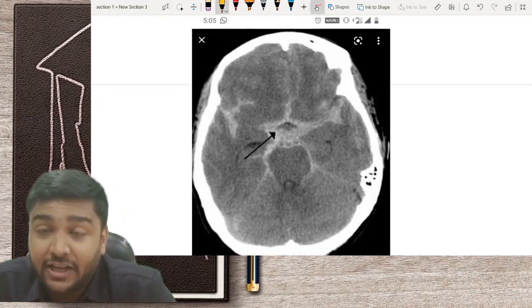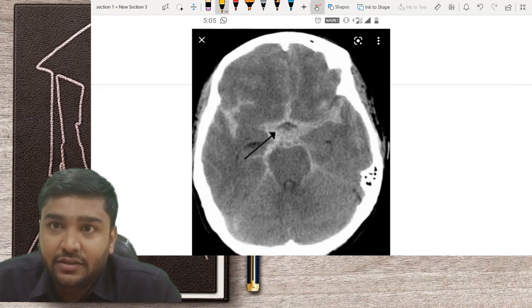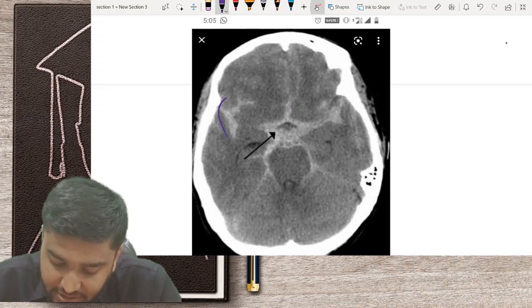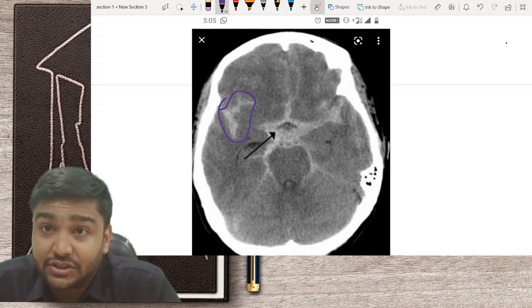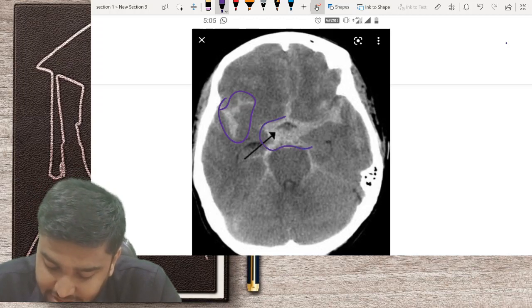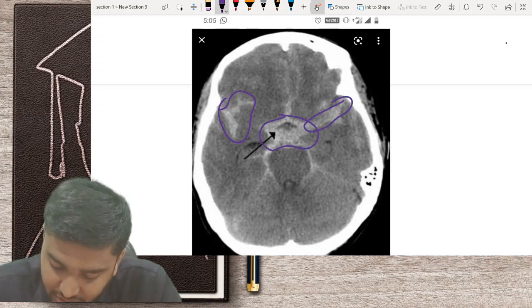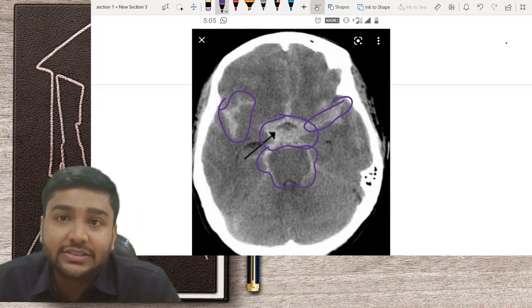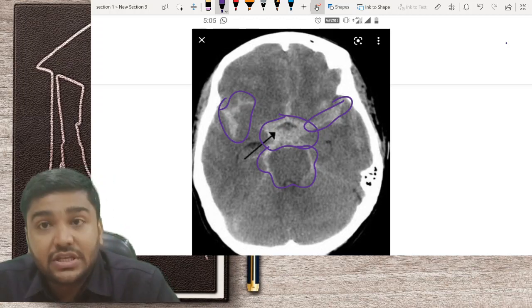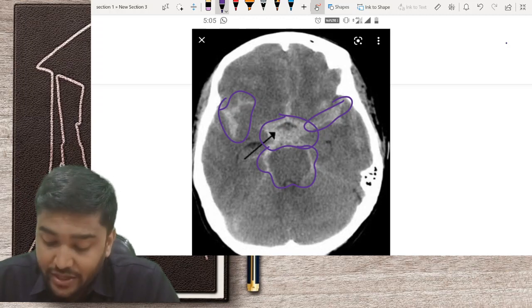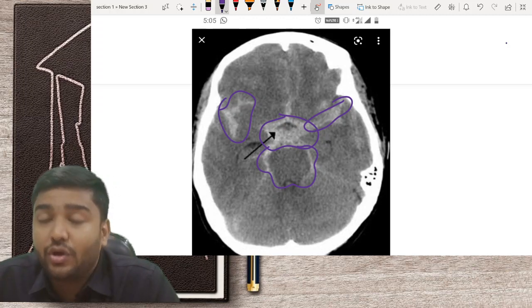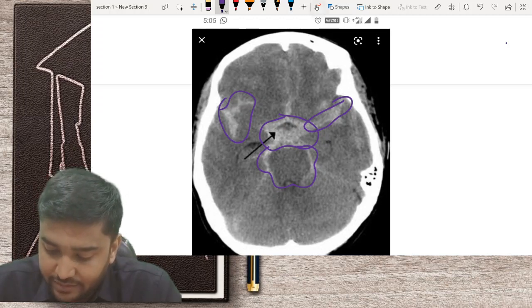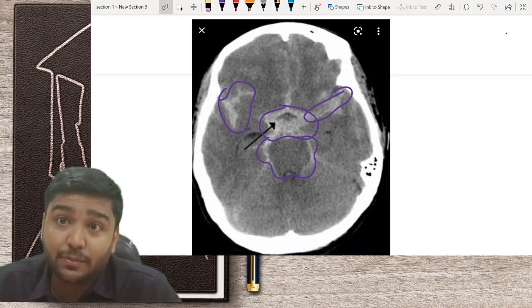This is another very classical CT scan — anything white is blood. Here we can see the sylvian fissure, which normally contains CSF, and these are all basal cisterns. When blood fills the sylvian fissure and basal cisterns, this is a very typical subarachnoid bleed. Subarachnoid bleeding happens due to aneurysmal rupture, and whenever you see this kind of bleeding, you must advise a digital subtraction angiography or CT angiography of the brain.